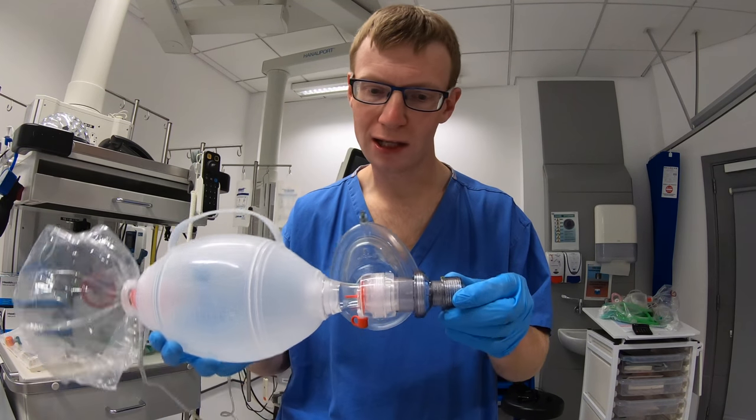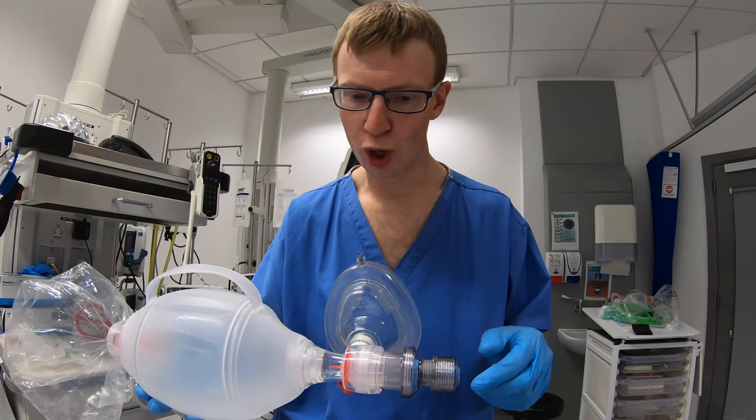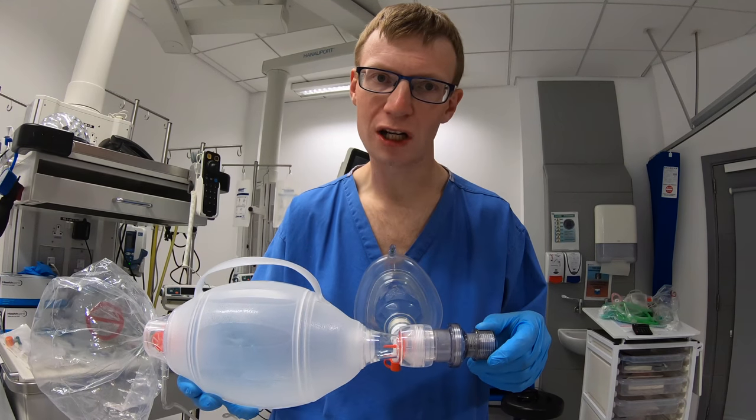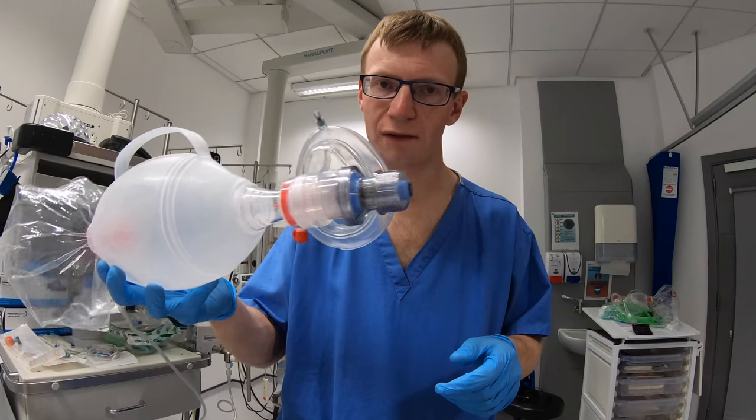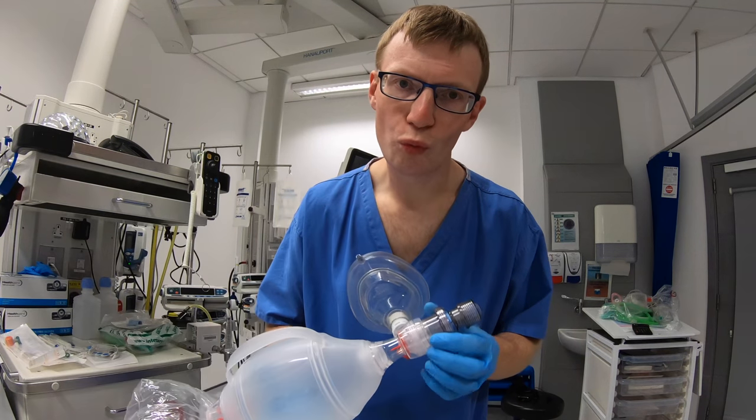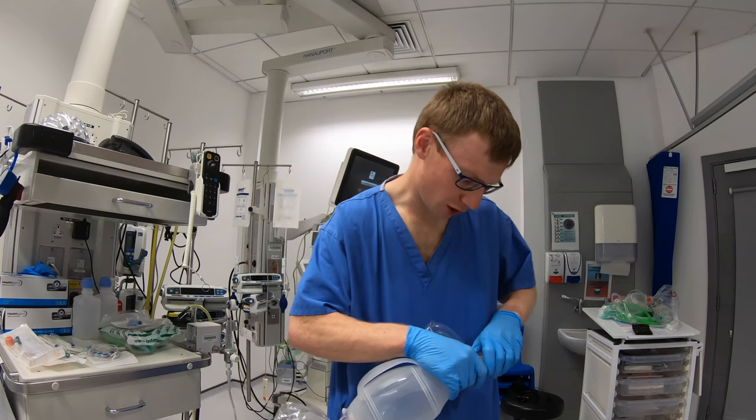So I think I can very safely say that with a patient, one bag valve mask may vary to the next, but I don't think I can recommend that you have this on a patient without delivering positive pressure ventilation.